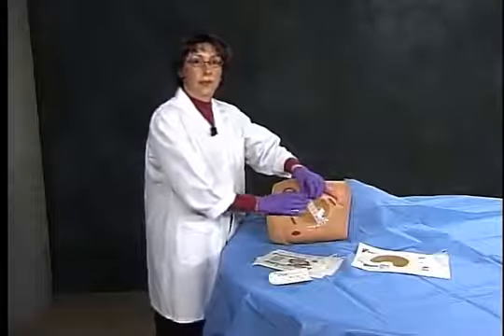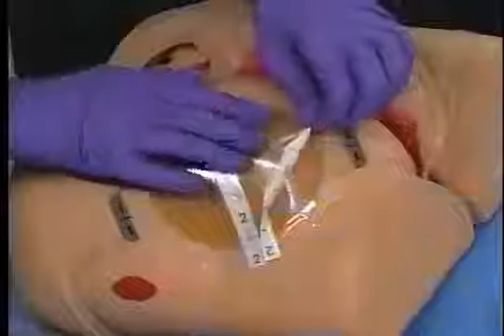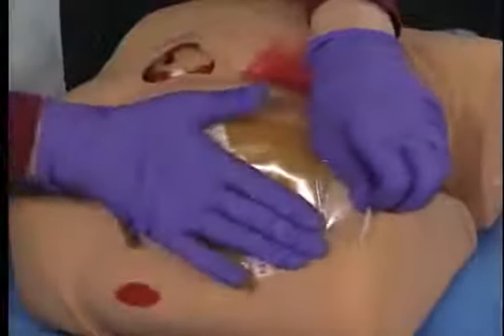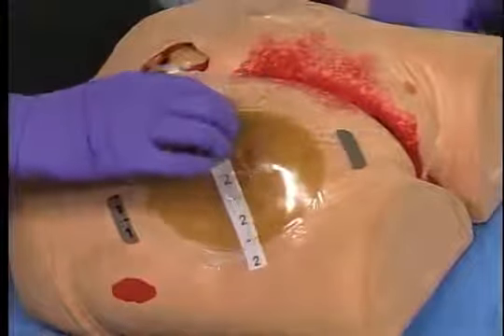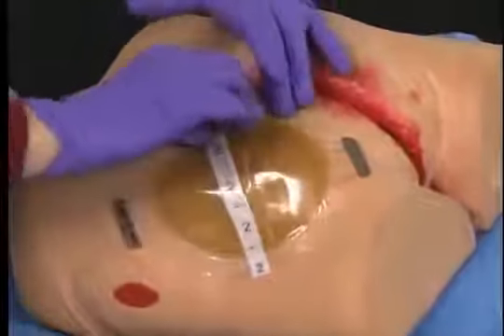Remove the delivery film by lifting one of the center tabs marked number 2, pulling toward one edge and smoothing the dressing to the edge. Then repeat this for the other side.